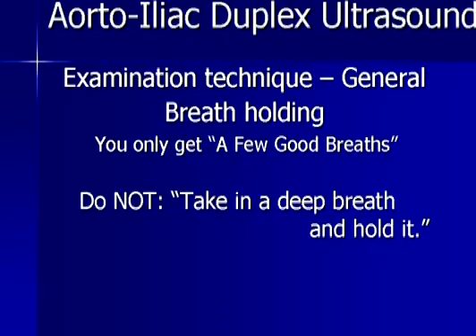So, in the you only get a few good breaths category, do not have the patient take in a deep breath and hold it. What happens is they might give you a good effort the first 1 or 2 times. They won't give you very good efforts after that because it's too much work for them. The other thing that happens, and it really is detrimental to the quality of the study, is if a patient takes in a very deep breath and holds it, their abdominal wall tends to become very rigid and firm, and you are not able to push as you need to with your probe. You're struggling against the patient, working against what they're trying to do, and it is very counterproductive to a good quality examination.